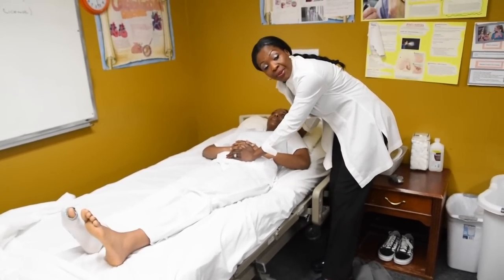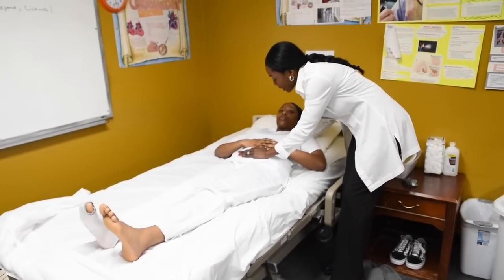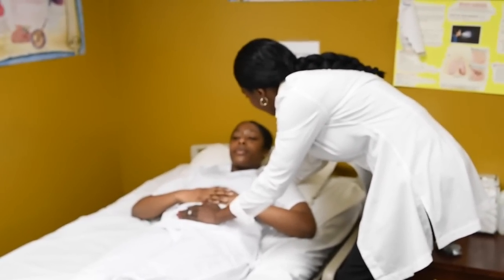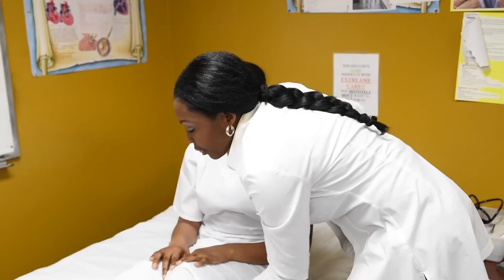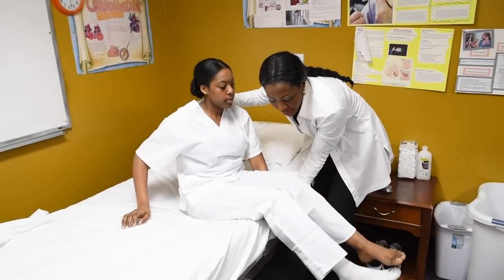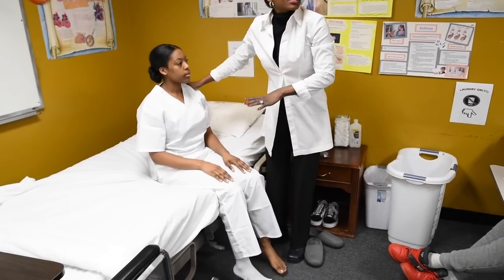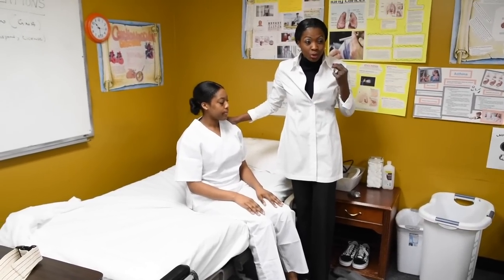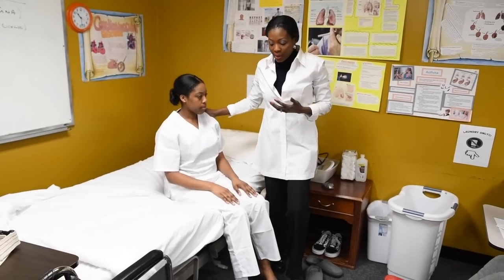This is how we transfer patients when we are moving them from bed. You're gonna support the patient's abdomen, support their back. Miss Nafisa, can you please help me sit up? Okay, sit you up. Then you go behind their knee and transition them. Please come to the edge of the bed. As you see me, when you start, the examiner is gonna tell you the patient is alert and oriented, so you can give them instructions to help you. And they would, all right?